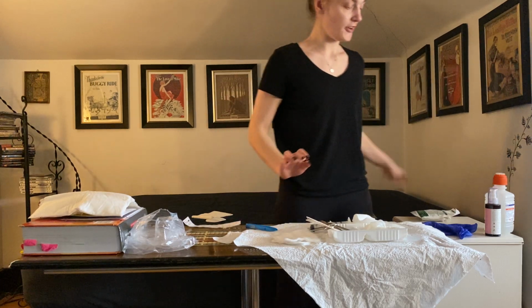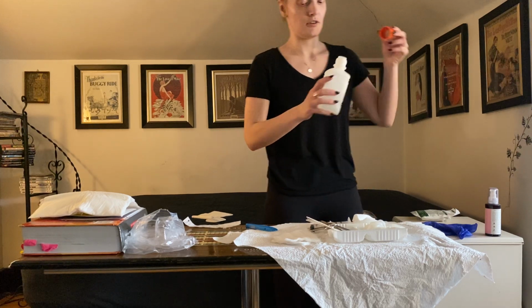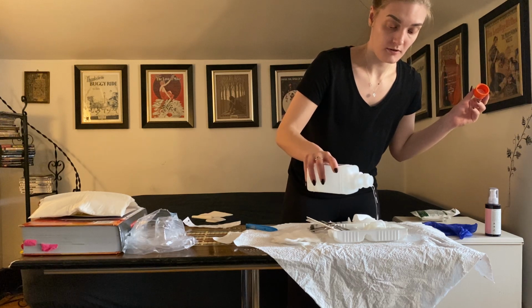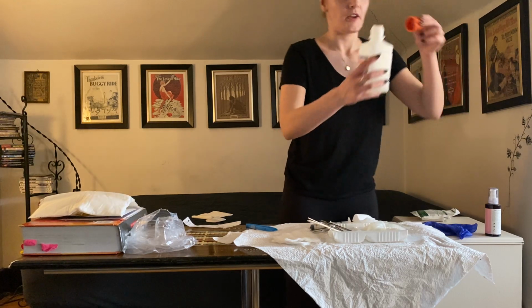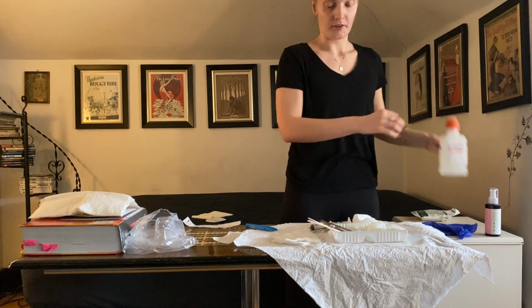I'm just going to add my normal saline, just being mindful because I don't want any drips to get onto the field. Okay, and I didn't get any drips outside the tray, so that's good as well.